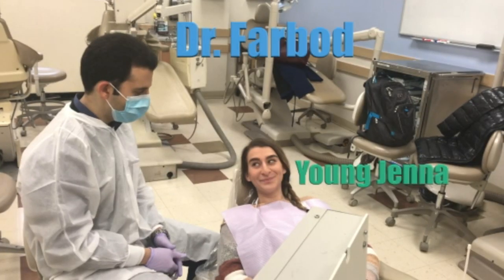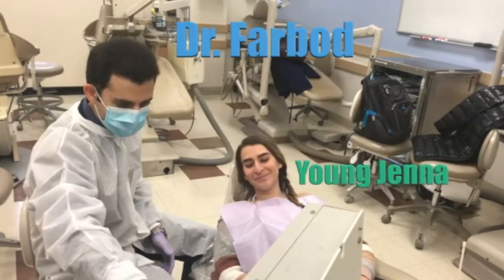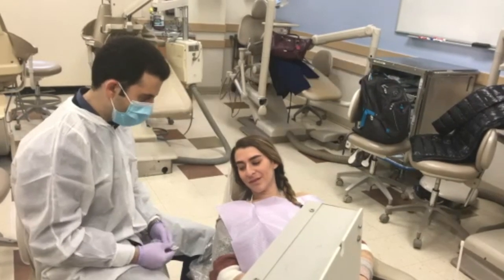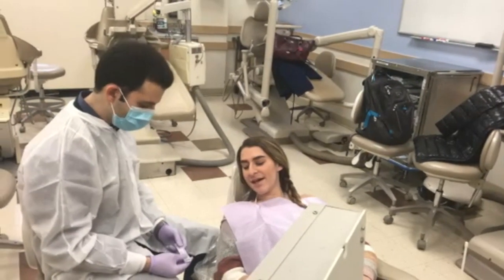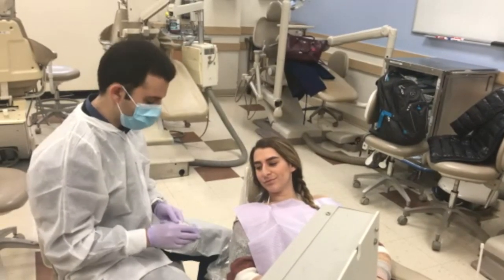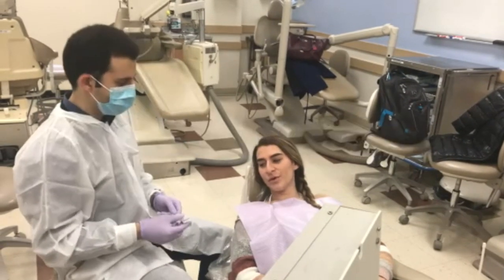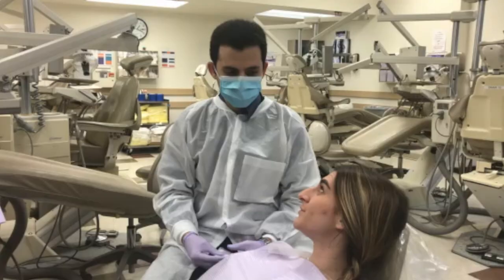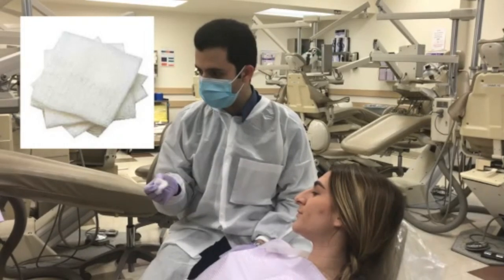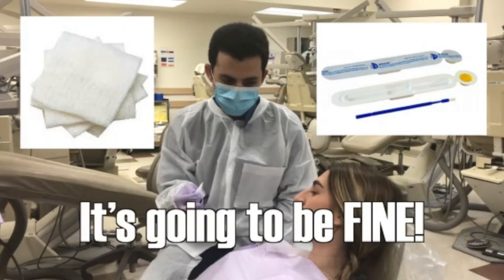Hi Jenna! How are you doing today? Hi, I'm good. So today we're going to do your fluoride varnish and it's going to protect your teeth from cavities. Do you know anything about that? No, what's in that? It's fluoride — it's going to be kind of sweet and a little sticky on your teeth. Okay, you're going to like it. It won't hurt? It's not going to hurt you, no. So now I have to dry out your teeth and then I can apply the fluoride varnish on your teeth. It's very soft and it's going to be fine.